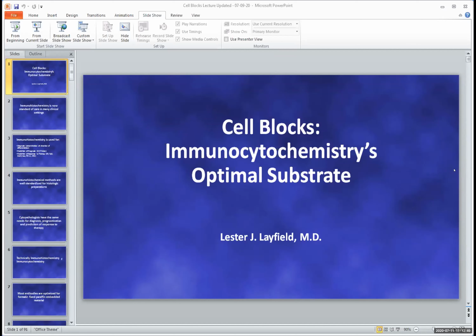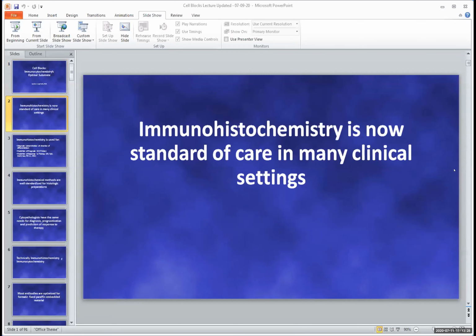And I usually believe that it's very helpful to do rapid on-site evaluation so that you can actually triage your material optimally. Clearly, if you think something's a lymphoma, cell blocks are probably not the optimal way to go. You can put it into RPMI and send it for flow cytometry. However, for the vast majority of other lesions that you're considering a differential diagnosis in, the preparation of formalin-fixed, paraffin-embedded cell block material, I think, is optimal, and I'll review some of the reasoning behind that statement.